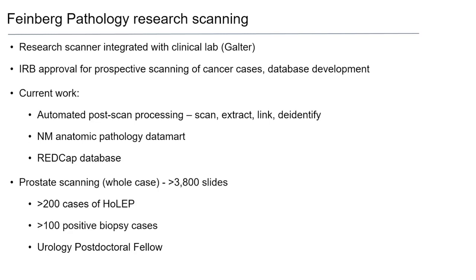And just by doing an AI analysis of those slides, on top of NCCN and a few clinical features, they could predict distant metastases with an AUC around 0.85. And just seeing what is possible, I think this could be a very interesting avenue for research.